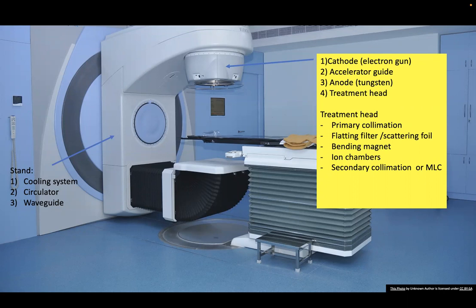So the cathode is a part of the X-ray tube where electrons are produced. And that's produced by a process called thermionic emission, which we'll get into in a little bit. By providing a voltage from the cathode to the anode, we can move those electrons towards the anode part of the X-ray tube.